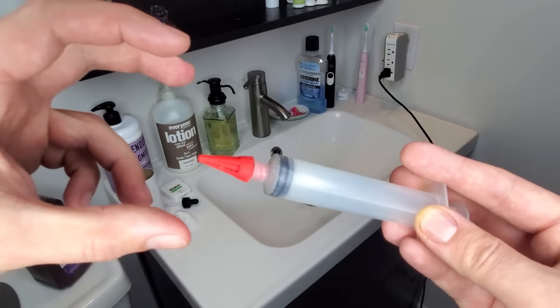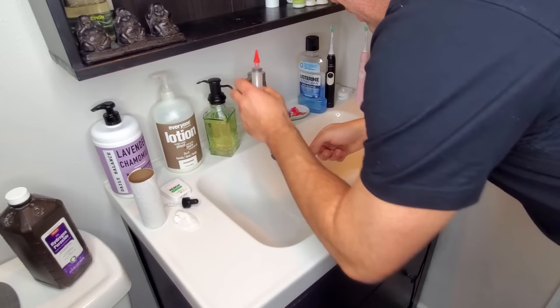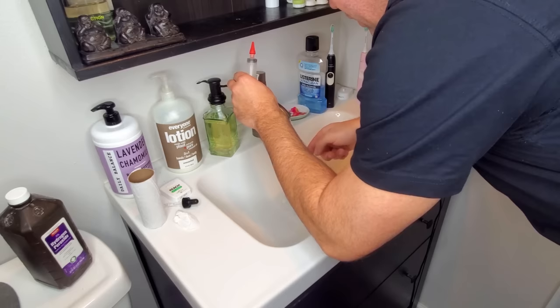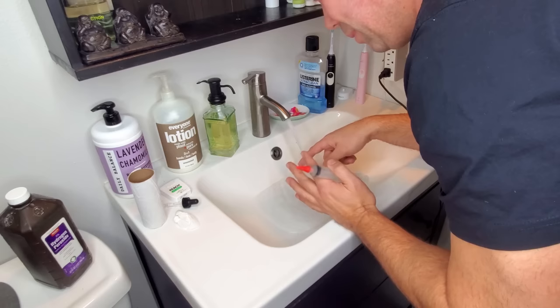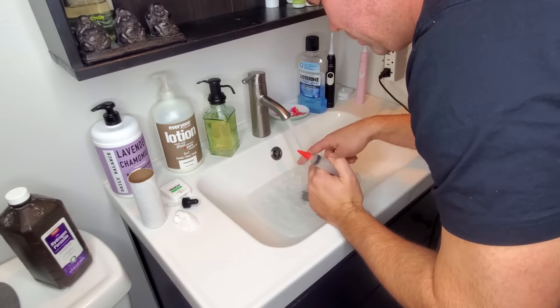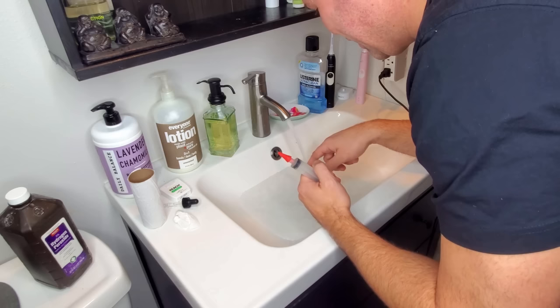So I usually run some hot water — not extremely hot, but medium to hot. I kind of plug up my sink like so. This is a really pleasurable experience, let me tell you. It actually feels really, really good. It feels like you have an itch deep down in your ear and this thing is just scratching it. So I actually kind of look forward to this every couple of months.